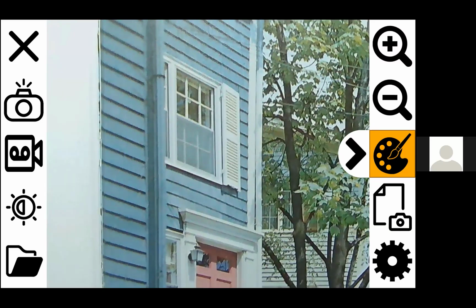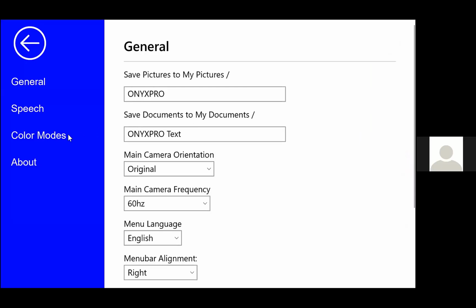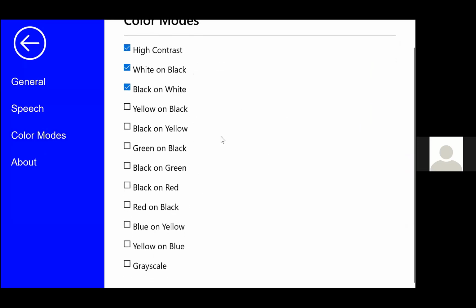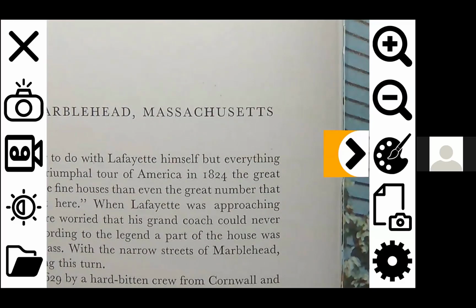One of the things I also want to mention is if you go back into settings and come over here to color modes, you have a lot of different options that you can check off. I chose to just check off high contrast, white on black, and black on white. But you can add any of these other ones in by just checking the box next to them, and that will then be added into your presets. So now we're back here to our menu.